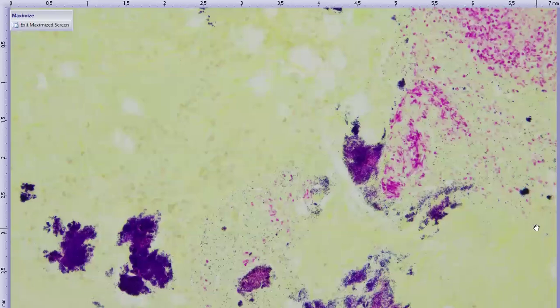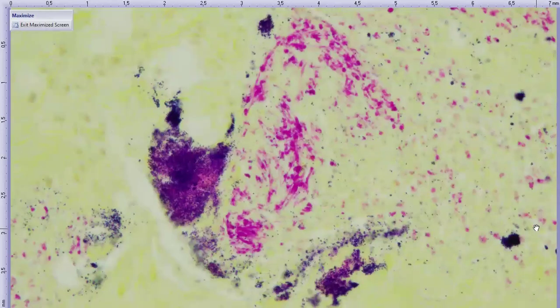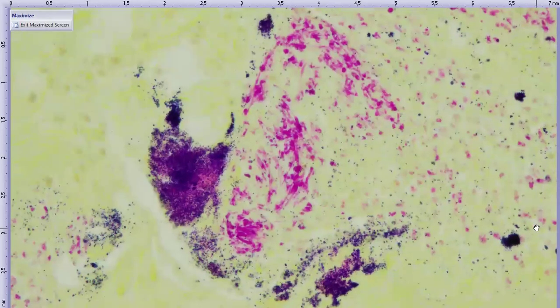So this is a very unusual lesion in cats. At least I would say that we don't receive this very often. I feel like more often it's surprisingly an orbital fungal infection, an actual fungal infection, as opposed to this pseudo fungal infection that's actually bacteria.